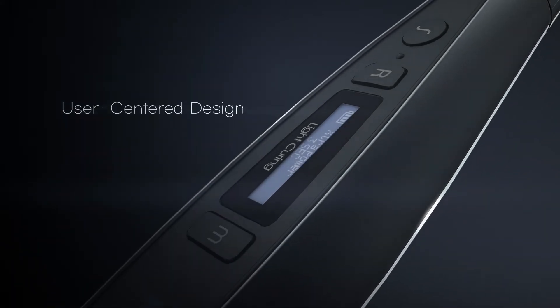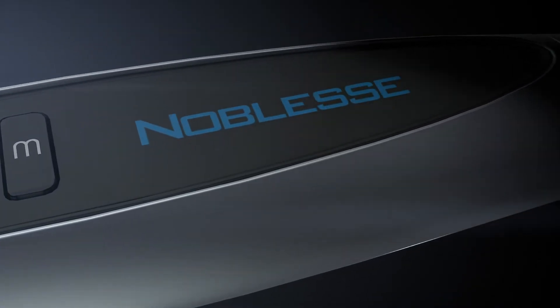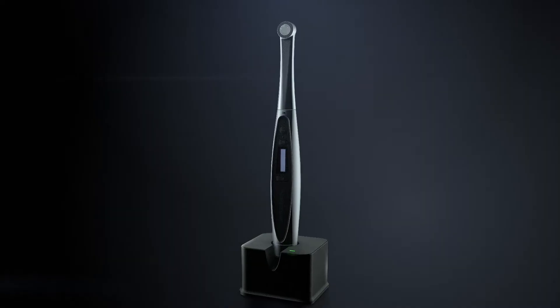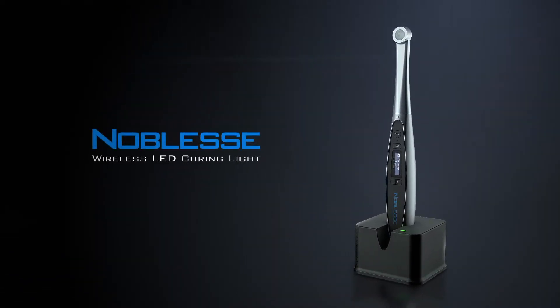User-Centered Design. Noblesse Wireless LED Curing Light.